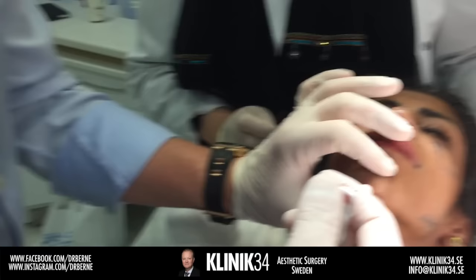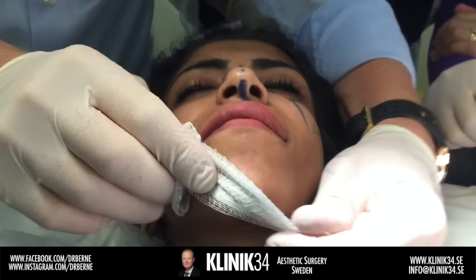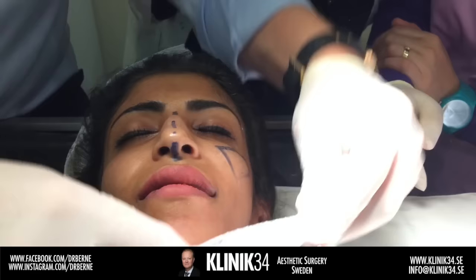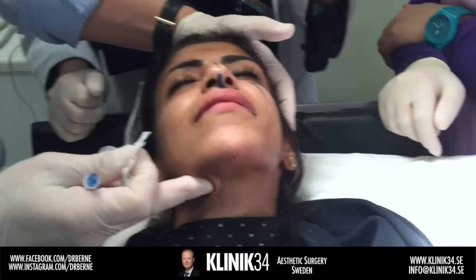The next step — could I have a gauze please — is to create a better shape, and this is what I call the Korean technique, which I picked up in Korea. We use the gauze to create a nice smooth, pointy shape of the filler. You can see we have a nice projection, but in my opinion she needs more — we need to bring it in more, so now we're going to do the lateral approach.